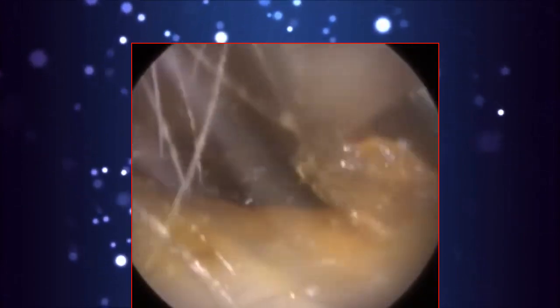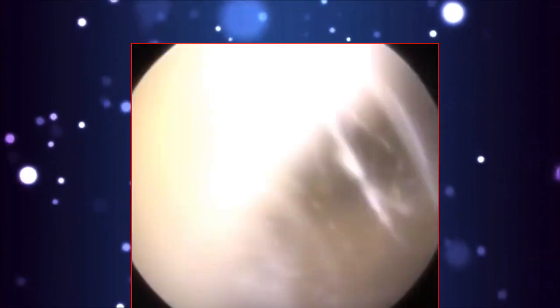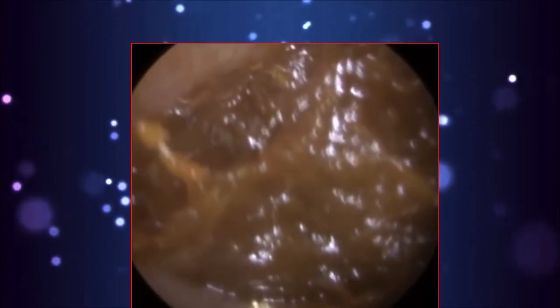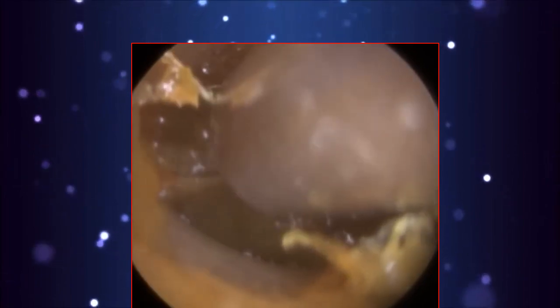You see we've got a large plug of soft wax there, and this final plug of wax is a bit more medial, it's towards the eardrum. Patient has got somewhat an inclined ear canal, so it does go up quite a lot, which most people's ears do, around 30 degrees in trajectory. However, I feel this patient has a bit more of an upwards trajectory. And the ear canal is a bit bendy as well.